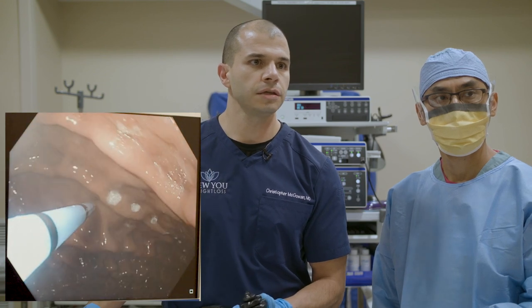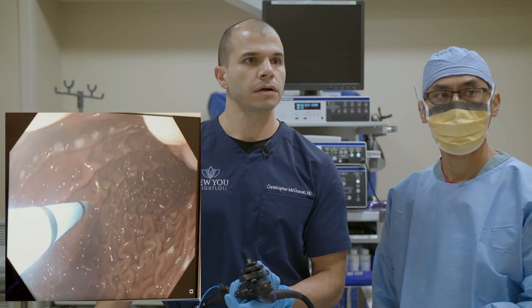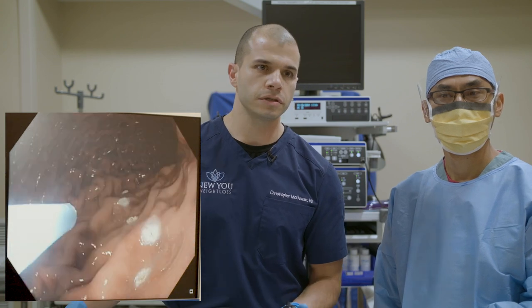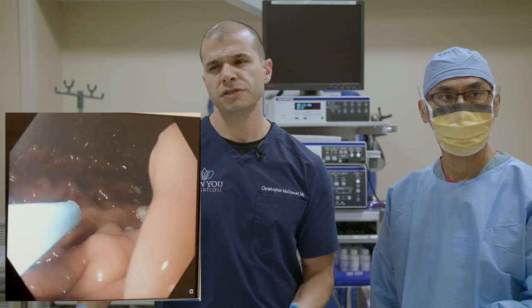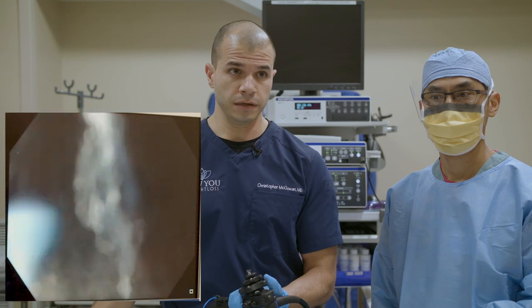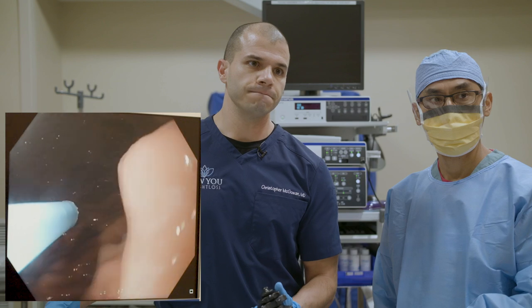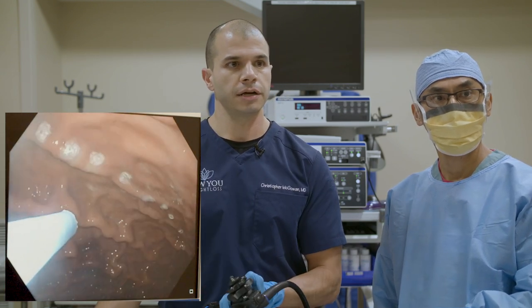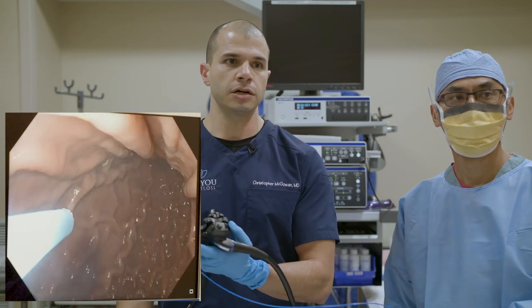People ask how much weight you can lose with the endoscopic sleeve. On average, in our patients at approximately a year after the procedure, they lose 23% of their total body weight — that's data from our first 100 patients. If you start at about 200 pounds, you can expect to lose approximately 50 pounds on average, which is quite similar to the surgical sleeve gastrectomy, maybe just a bit shy of that. We're going to suture the front and back lines together, making the stomach much narrower.